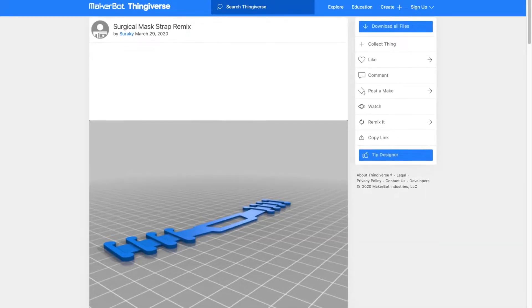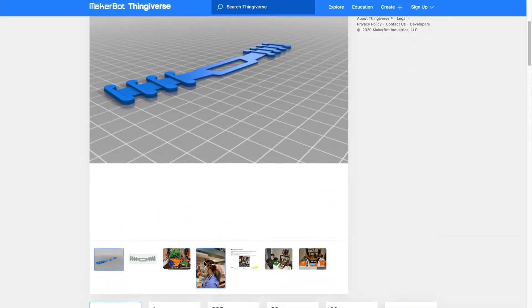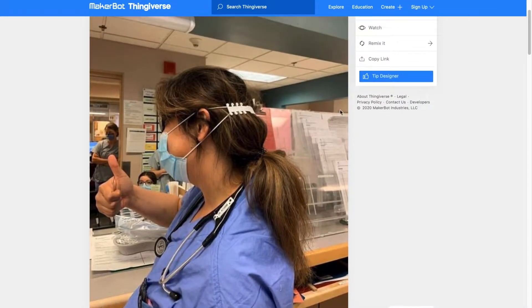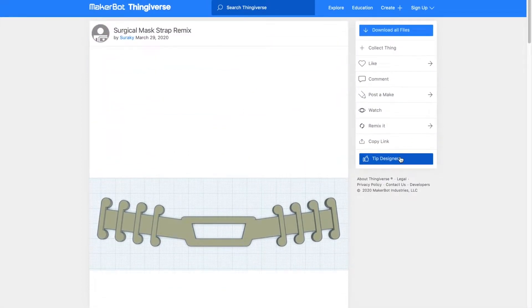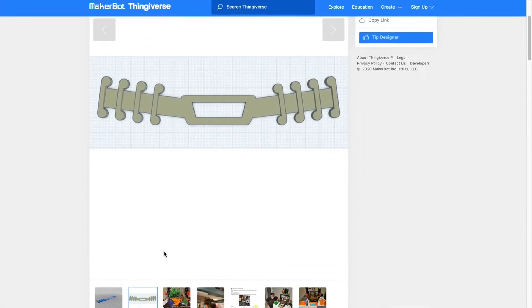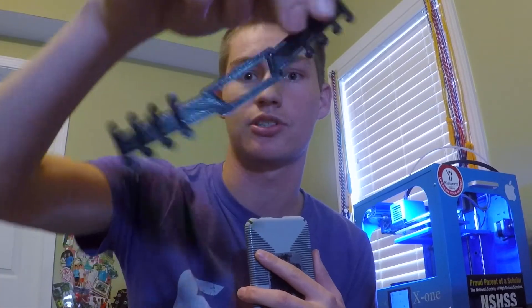Now that I've wrapped up talking about the masks, I want to talk about these ear savers. With a surgical mask, the strap goes behind the ear and typically rubs on the ear, which can cause discomfort. These mask straps are designed to hook onto the straps of surgical masks to basically save your ears from discomfort after long days of working in hospitals.